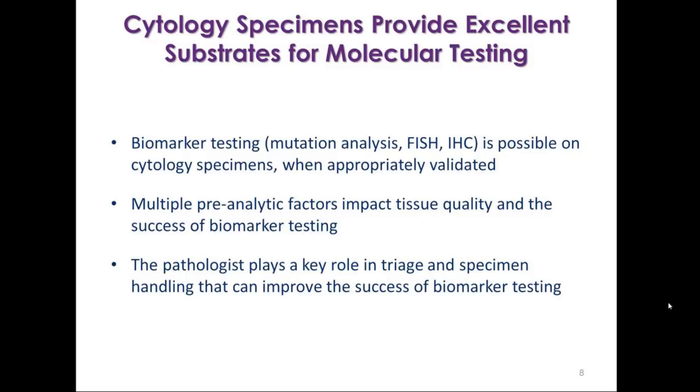However, what's important to remember is that cytology specimens are a little different. They utilize many different kinds of fixatives and stains. And so when most assays in the molecular lab are validated on formalin-fixed tissue, so most protocols are designed and optimized for FFPE, you do have to appropriately validate your cytology specimens.